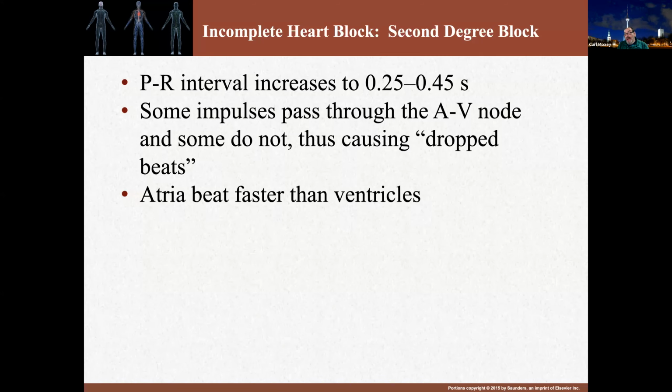Now, we divide second degree heart block into two categories: second degree type 1 block, Mobitz 1 or Wenckebach block, and second degree type 2 block, or Mobitz 2.